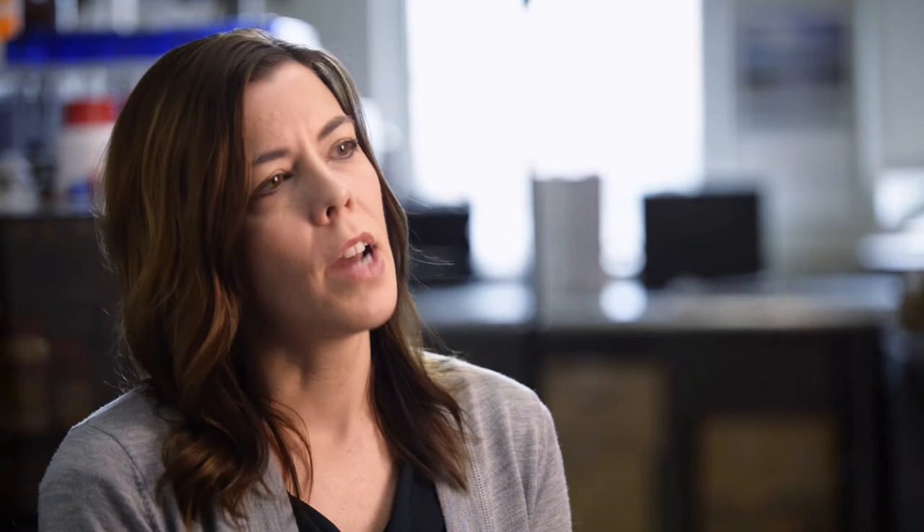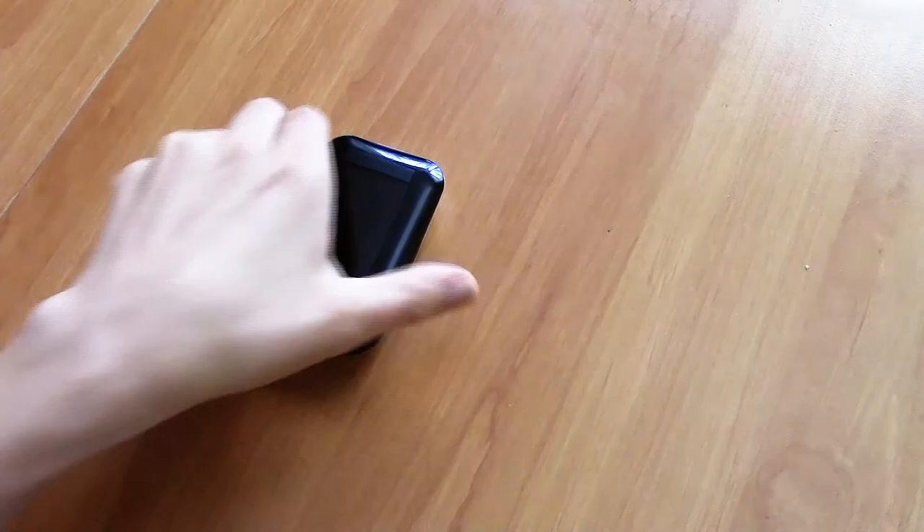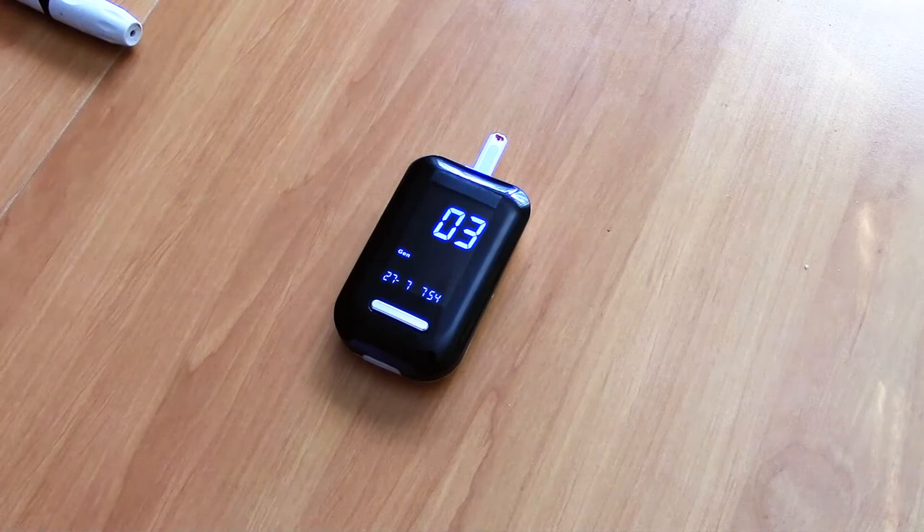What a diabetic has to do right now is do finger prick tests with something called a glucose meter. This finger prick test is just a one-time-point snapshot of what their blood sugar is. What we're trying to do is something very different.